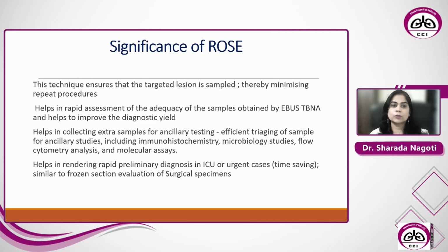Coming to the significance of ROSE, this technique ensures that the targeted lesion is sampled, thereby minimizing repeat procedures. It helps in rapid assessment of the adequacy of the samples obtained by EBUS TBNA and helps to improve the diagnostic yield. It helps in collecting extra samples for ancillary testing. That is, it helps in efficient triaging of the sample for ancillary studies like immunohistochemistry, microbiology studies, flow cytometry analysis, and molecular assays. It helps in rendering rapid preliminary diagnosis in ICU or urgent cases, thereby saving time.